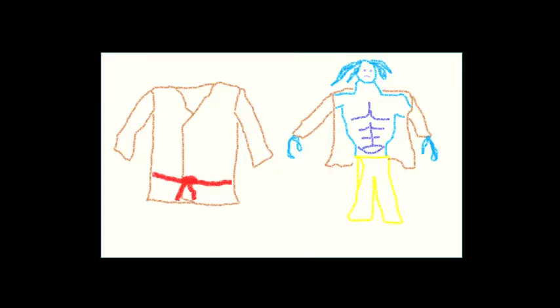The Jedi, on the other hand, have no problems with their outfits. Those robes open straight up. You can place the pads right onto the chest, so upper right-hand side of the chest, lower left. Wait for the unit to determine if it's a shockable rhythm, and get ready to shock.